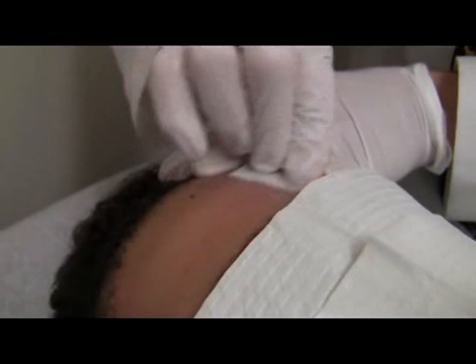Swab the area with alcohol. We're going to pan over here and clean the area with alcohol.